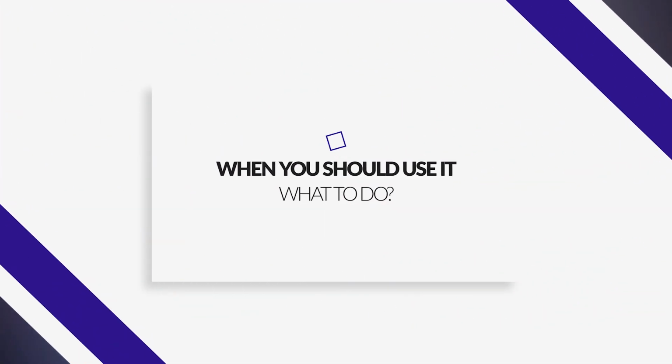That's how you use it. Now let's transition into when you should use it and what to do. I was speaking about this with the other audiologists on our staff at Treble Health, and we determined that the Noopl itself is going to succeed based on how the AirPods Pro or the hearing aids that you're wearing are programmed. If you just put AirPods Pro in your ears and use this, you'll get some benefit, but you'll be leaving a lot of potential on the table.